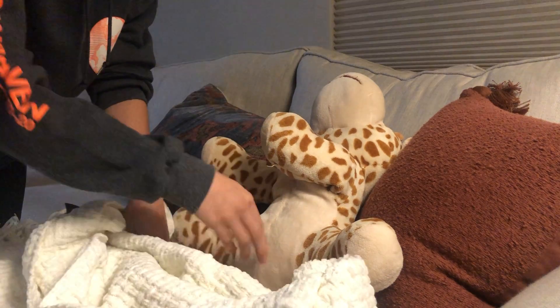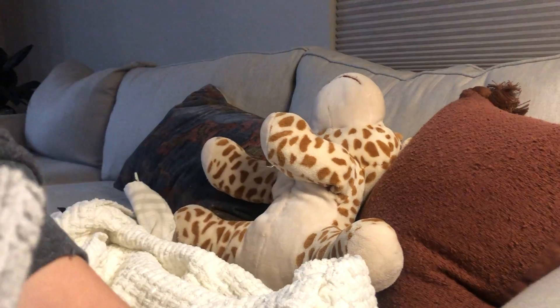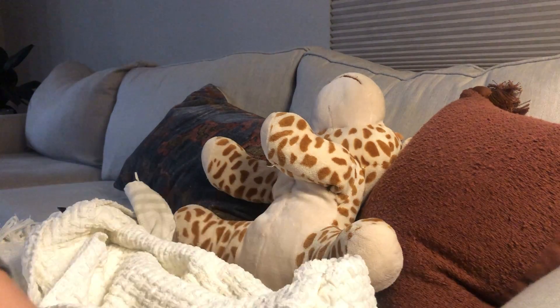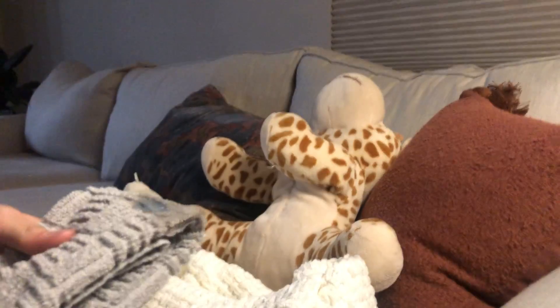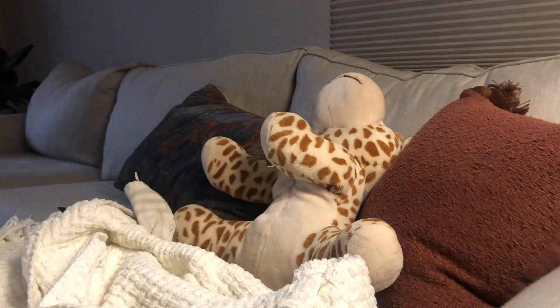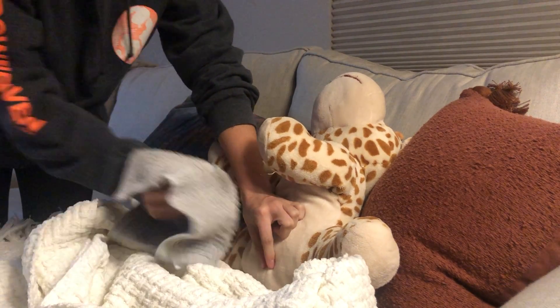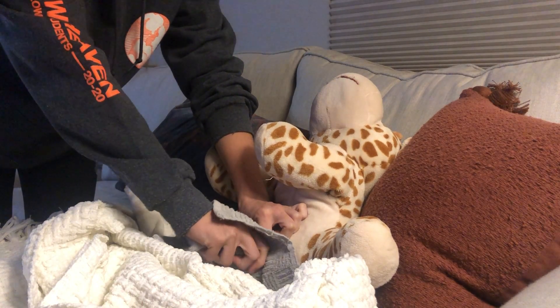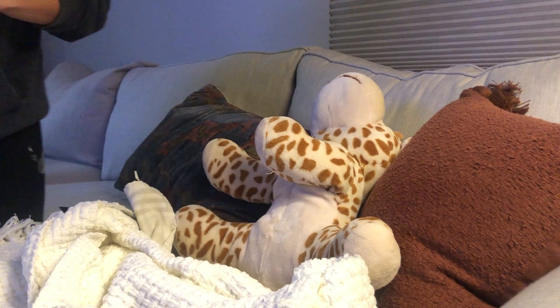I'm going to wet my washcloth in the water and apply soap to it, rubbing it around so it gets nice and soapy. Then I'm going to hold the catheter at the meatus and clean four inches with one swipe.